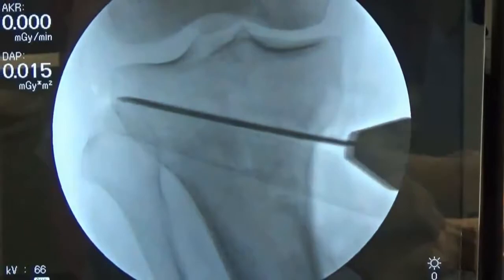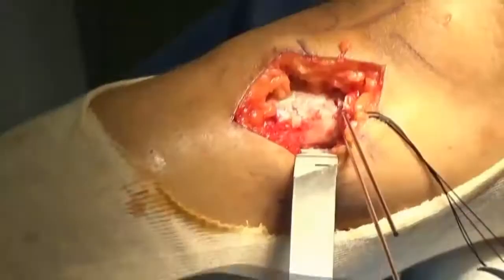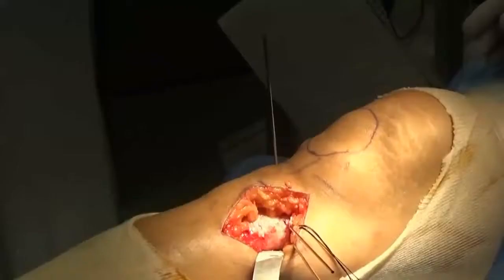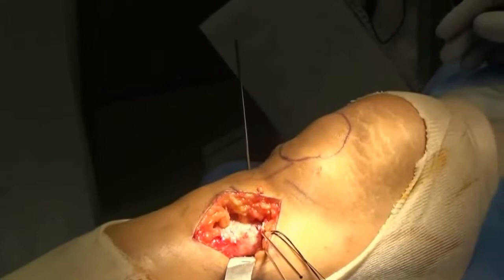Similar to OWHTO, two parallel guide wires are inserted from the medial tibial cortex toward the tip of the fibular head. A short hinge pin is then inserted into the hinge point under fluoroscopy.